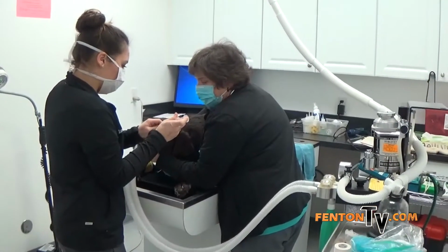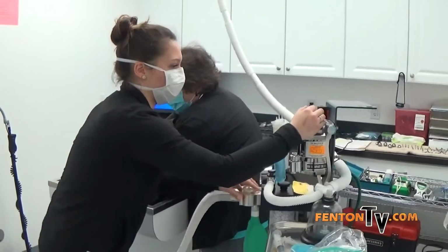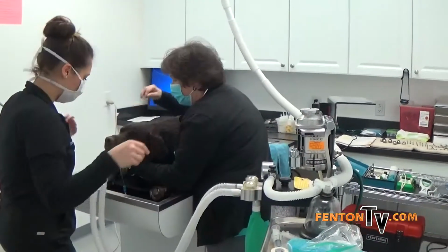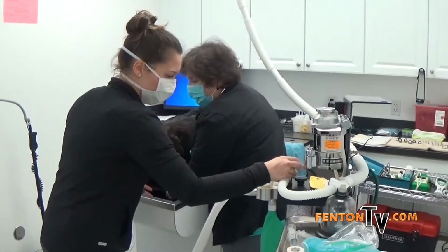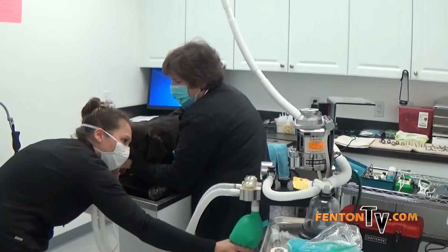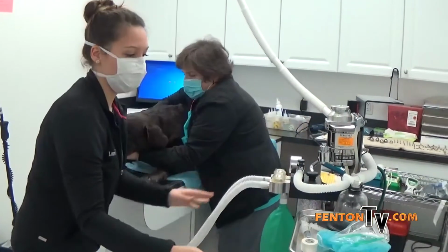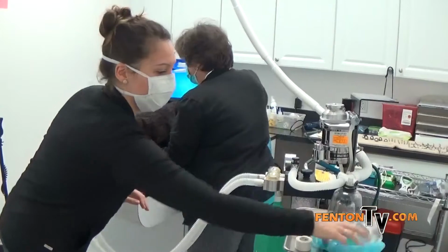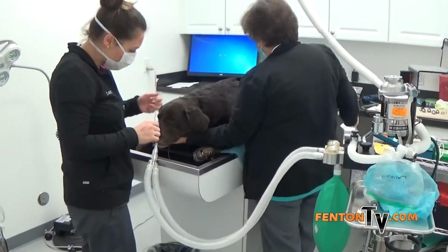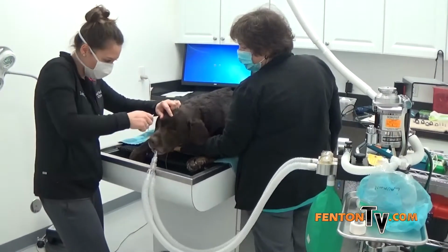And that makes a seal in the trachea, so nothing, water, anything gets down into his lungs during the procedure. Check it, make sure you don't hear any air, and that means it's formed a proper seal. They are unable to blink under anesthesia, so we do moisten their eyes.